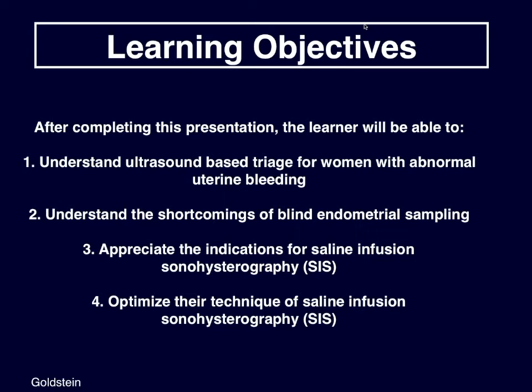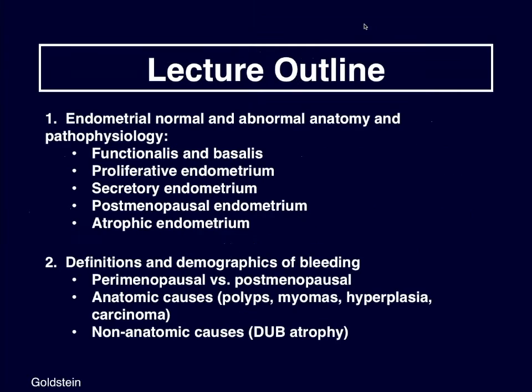My learning objectives: I want you to understand ultrasound-based triage for women who have abnormal uterine bleeding, the shortcomings of blind endometrial sampling, appreciate indications for saline infusion sonohysterography, or what we call SIS, and optimize the technique of saline infusion sonohysterography, or SIS.